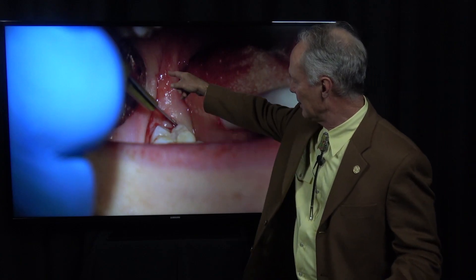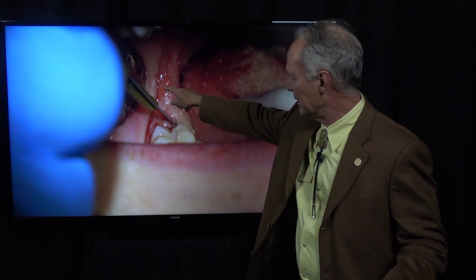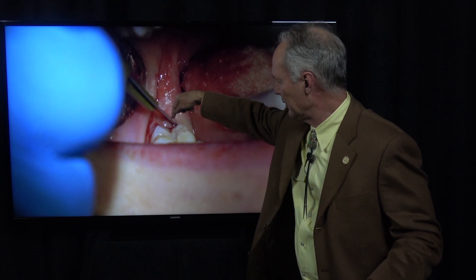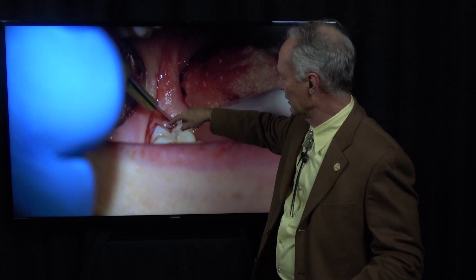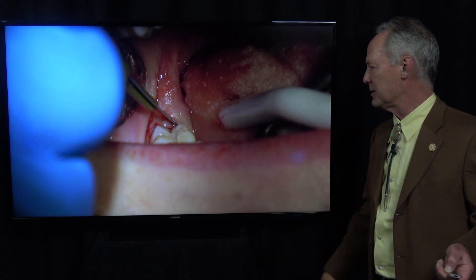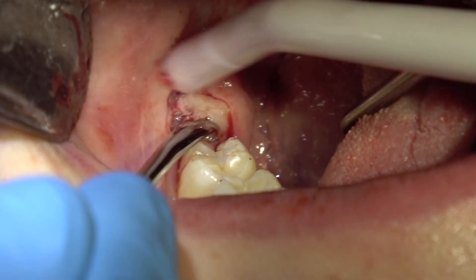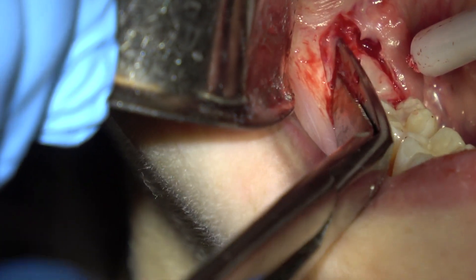I'm making the same incision here from the distal lingual of the second molar back, and then from the distal buccal of the second molar back. Then I'm going to cut across the distal of the second molar and create a little triangle. I want to remove that tissue so I have access to the impacted wisdom tooth. Just lift that piece right out with the periosteal elevator, then the rongeurs and scissors to release the periosteum.